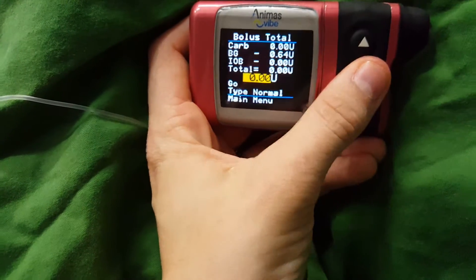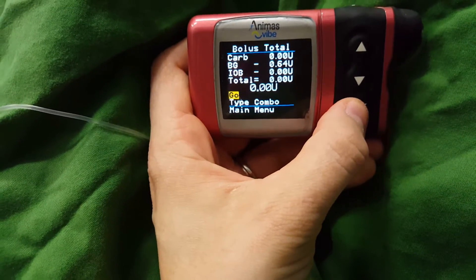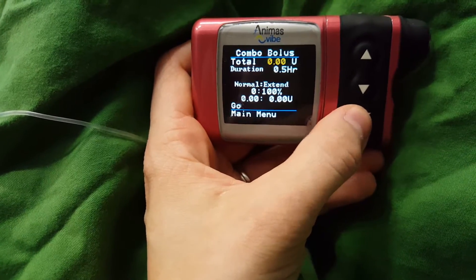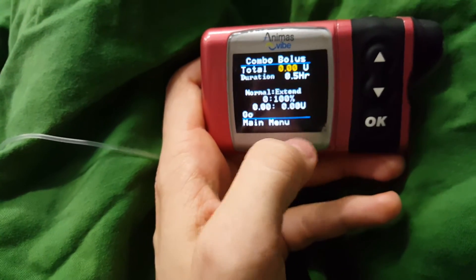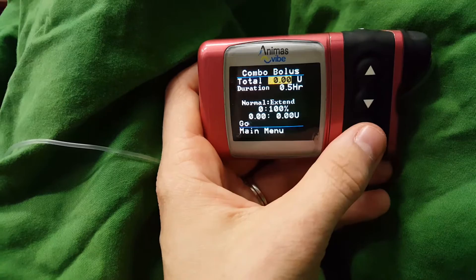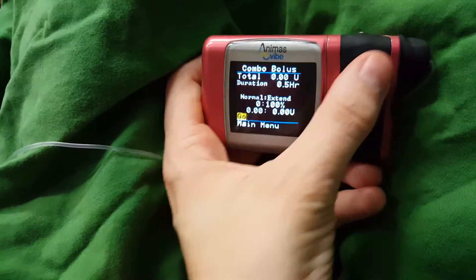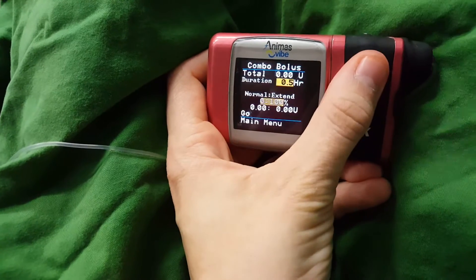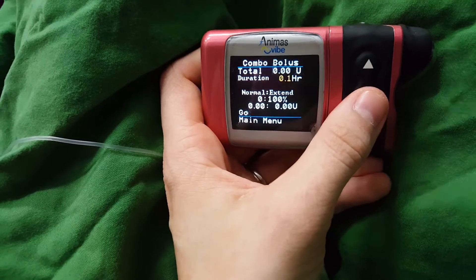You can also do a combo bolus, which really helps if you're giving yourself a lot of insulin or you're not quite sure — like if you're eating something like pizza, which has a really delayed effect on your glucose level. You can make it go for, I think the shortest time is 0.1 of an hour, which is about six minutes or so.